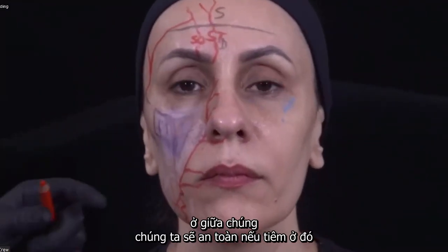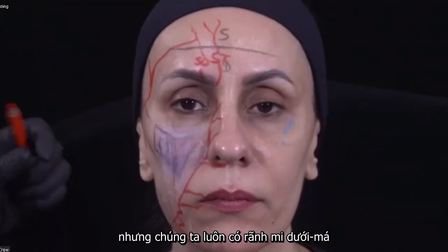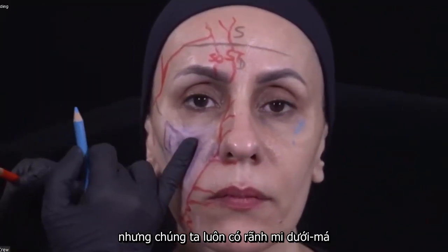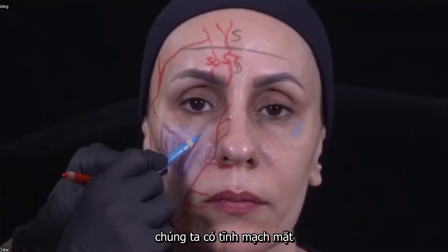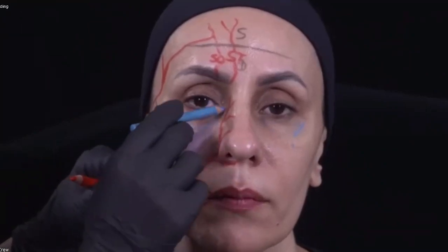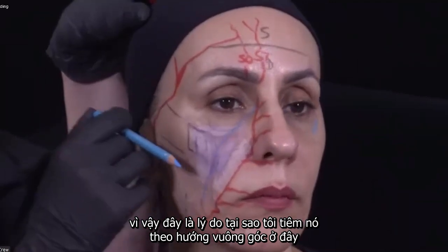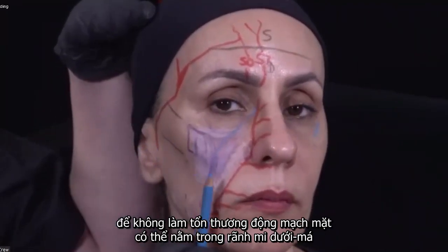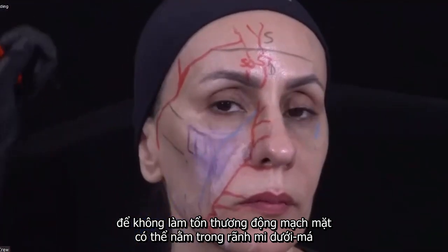In between, we are safe if we want to inject there. But we always have the facial vein in the mid-cheek groove. This is the reason why my entry point is lateral. So I am injecting in a perpendicular way here in order not to cannulate a facial artery that can be in my mid-cheek groove here.